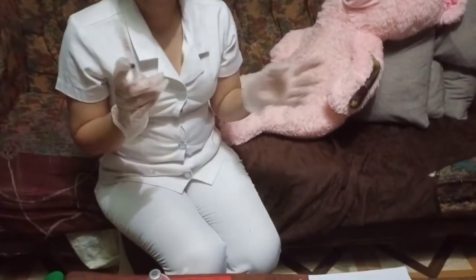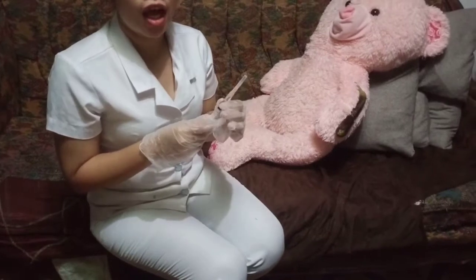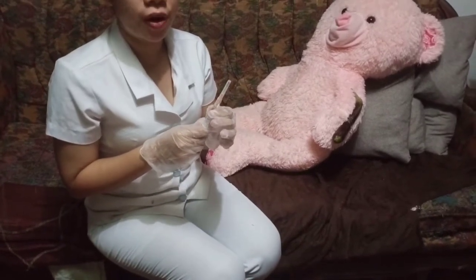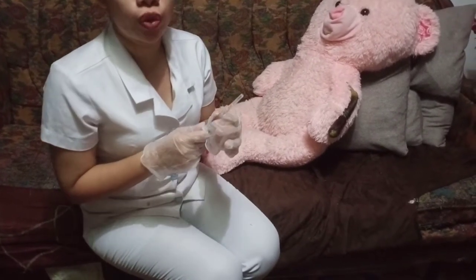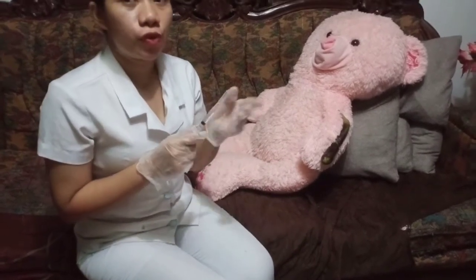Then grasp the syringe in your dominant hand close to the hub, holding it between the thumb and forefinger. Hold the needle almost parallel to the skin surface with the bevel of the needle up, at 5 to 15 degrees.